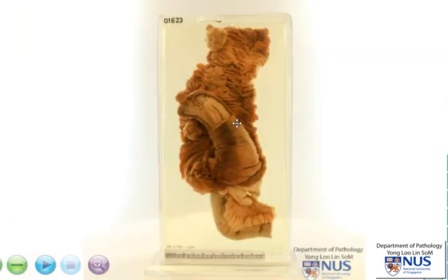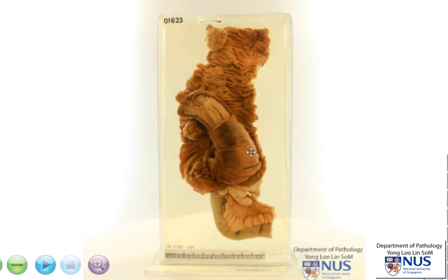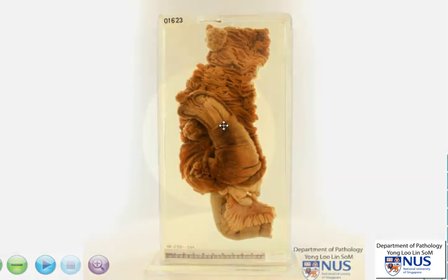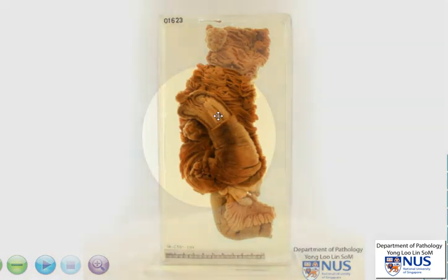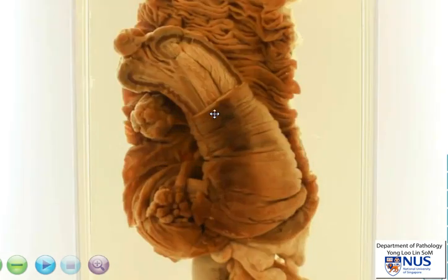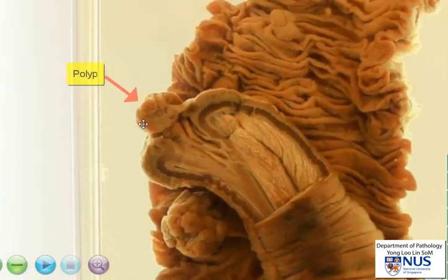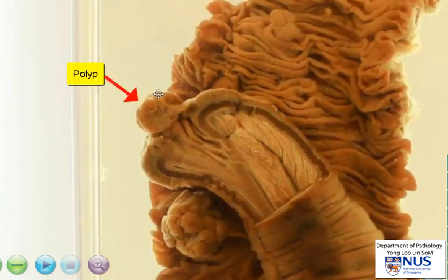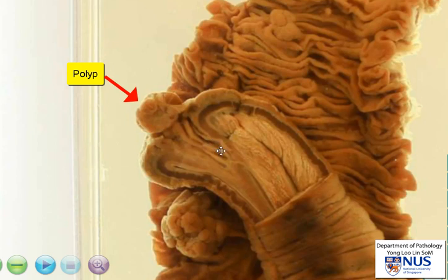Here is an example of a different case. You can see here that this is the area of intussusception. And if you look closely, we are actually able to make out that there is a polyp here right at the leading edge of the intussusception.